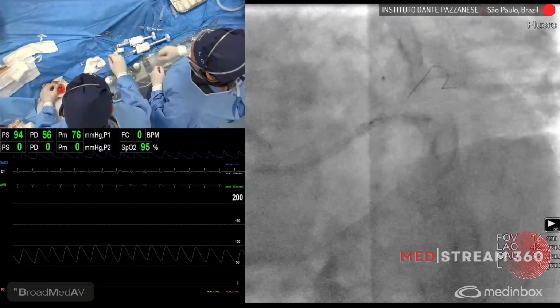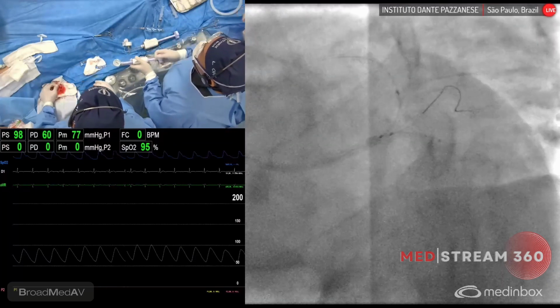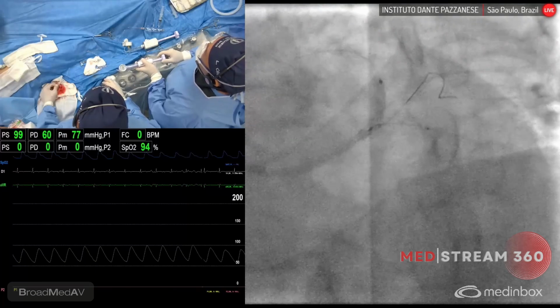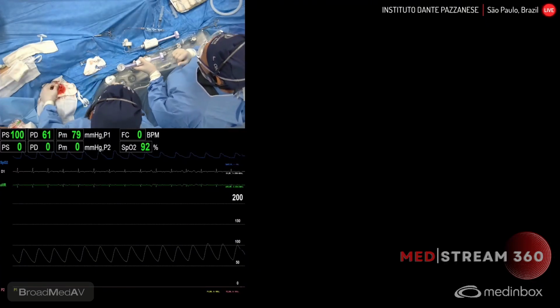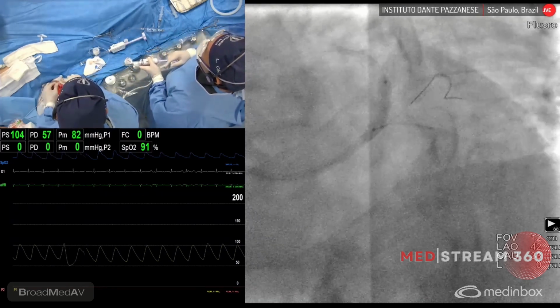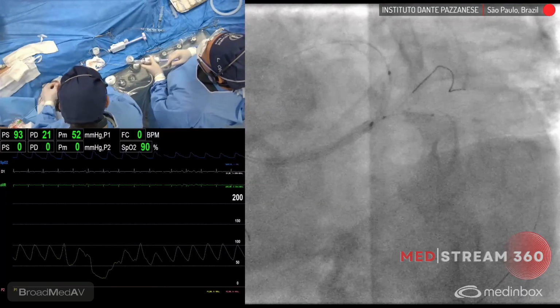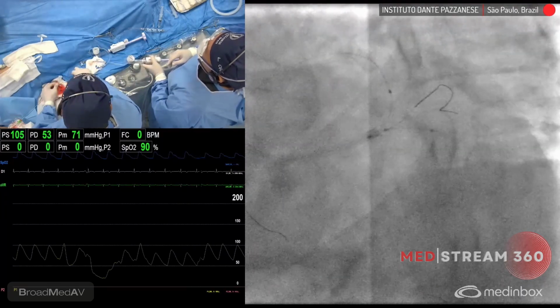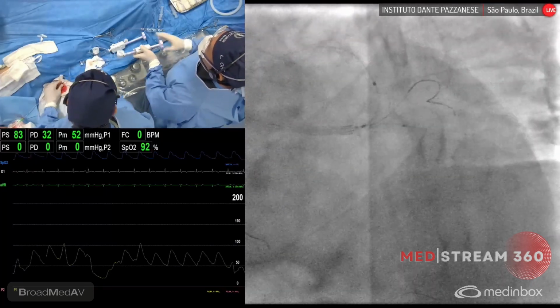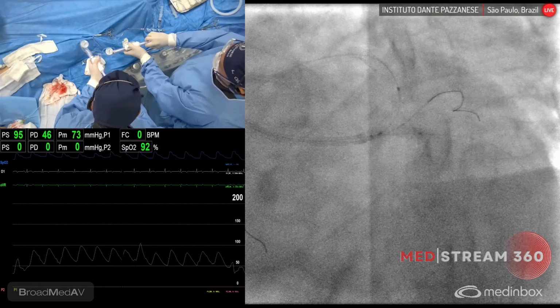Yeah. So the stent in the circumflex is being implanted here, covering the ostium. So Rodolfo, now you can do a post-dilatation with the same. Okay, so you're just making sure that there is no protrusion. Now Rodolfo is pulling here the balloon from the circumflex. Maybe that's a point that you can do a kissing here, right? 1, 2. Very fast kissing. 1, 2, 3. Okay, so it's a first kissing.